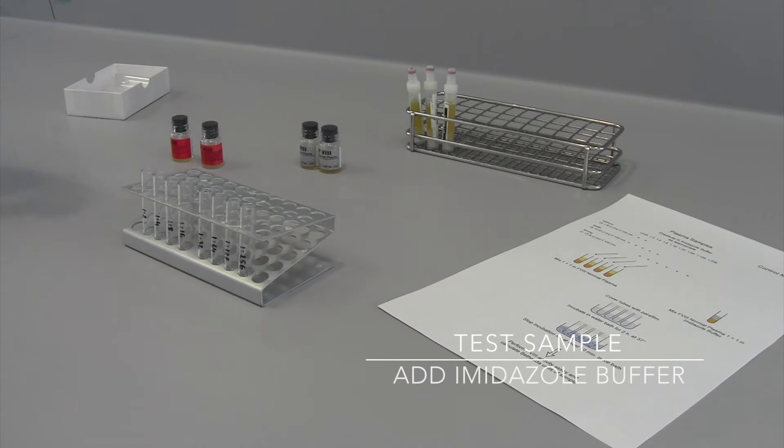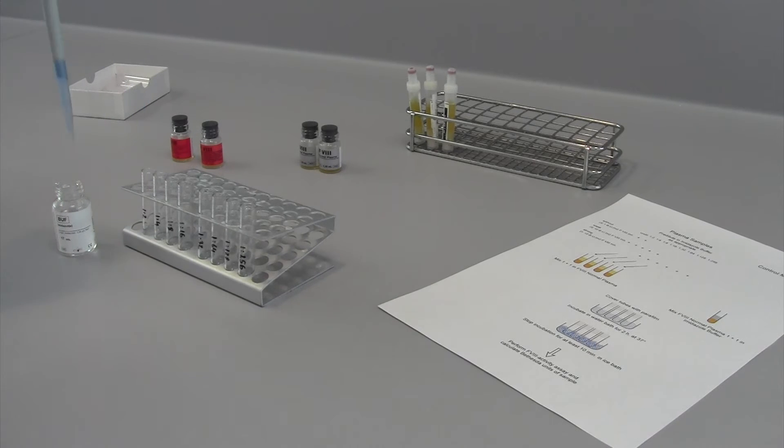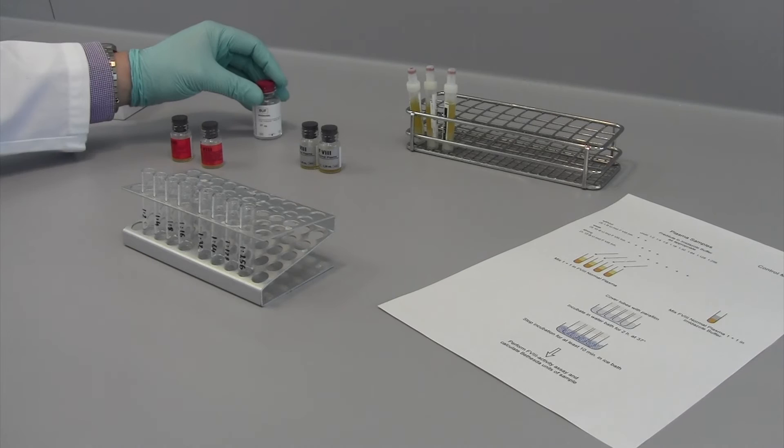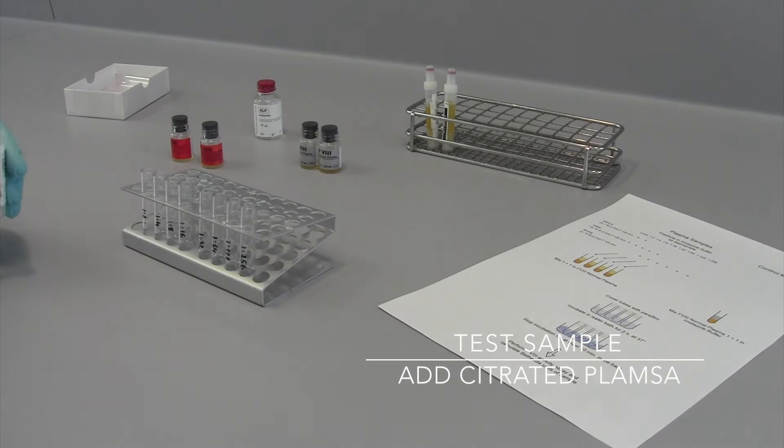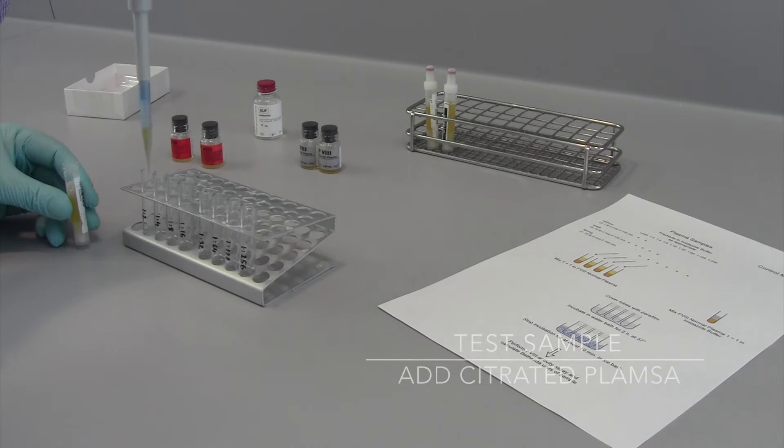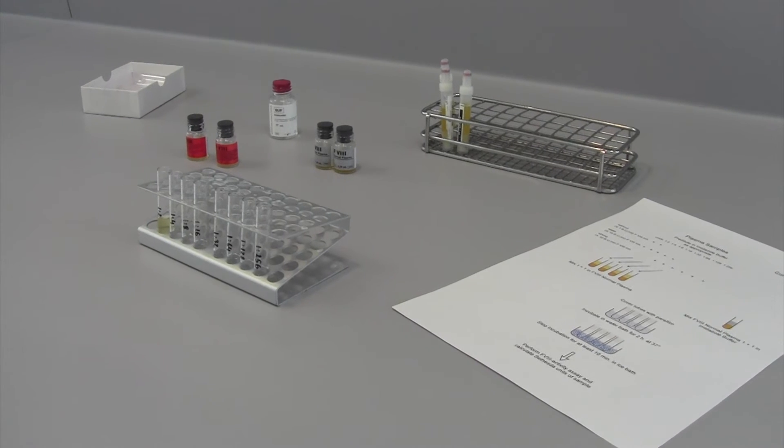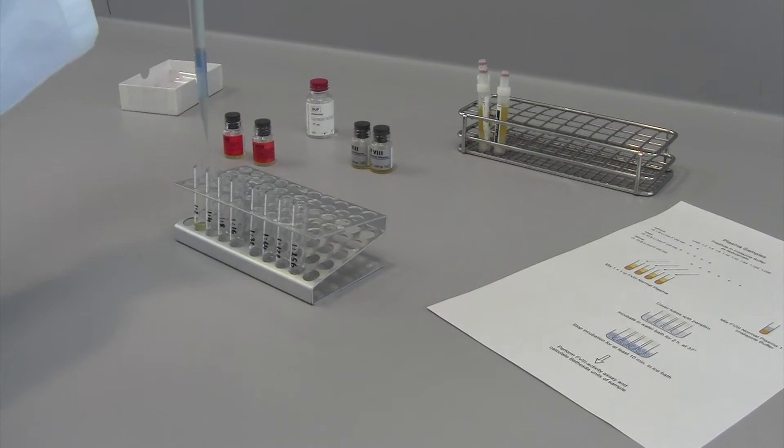Please pre-label the tubes and add 500 microliters of imidazole buffer to each dilution tube. Thereafter, add 500 microliters of sample plasma to the first dilution tube. Continue the dilution by transferring equal volumes from tube to tube. Please ensure adequate mixing.